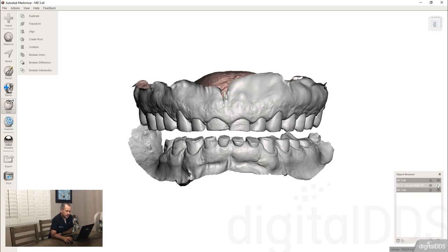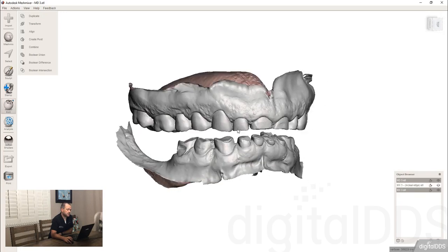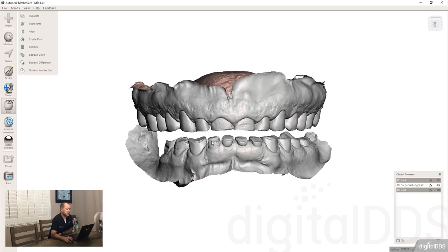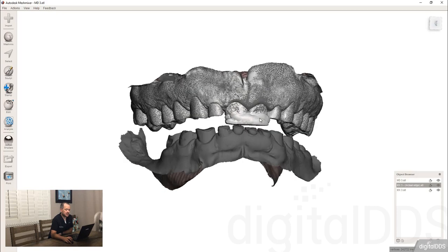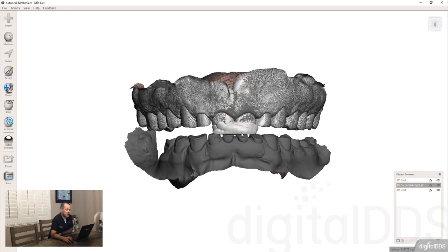So what we did on this patient is we scanned their teeth with this intraoral scan, but we also then scanned again after we had placed some composite on the patient's teeth to decide where we thought it would look best, okay? And that's what this right here is. So we added some composite until we were happy with it. You can see we've even flattened it off right here. But this is what we were able to put in clinically to say, yeah, that looks good with the length right there.